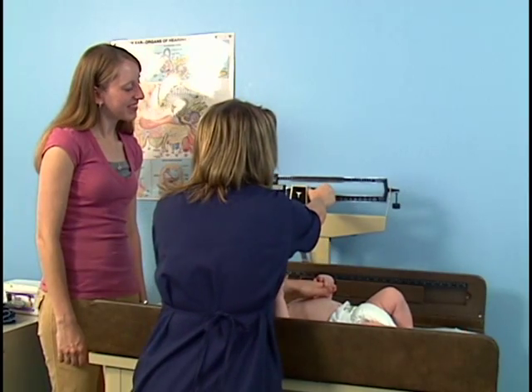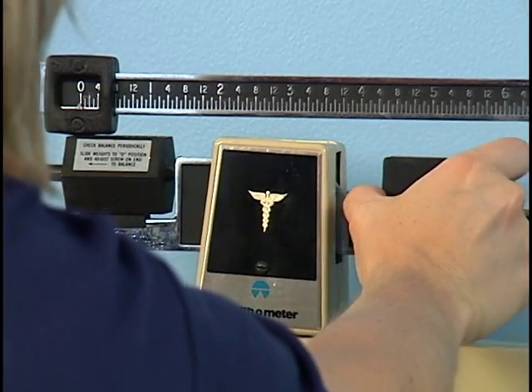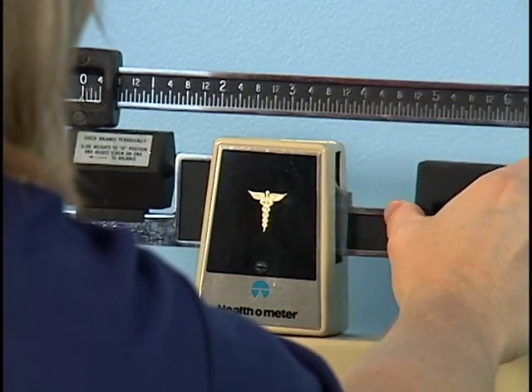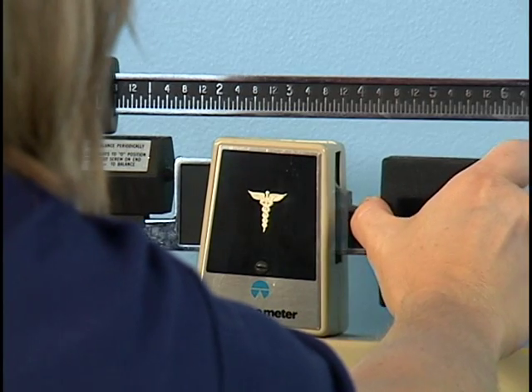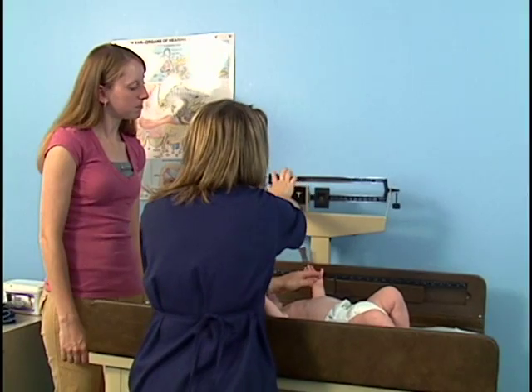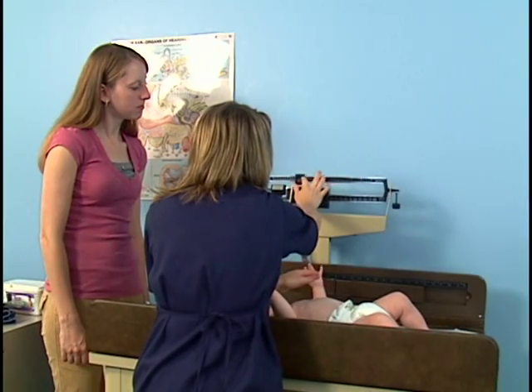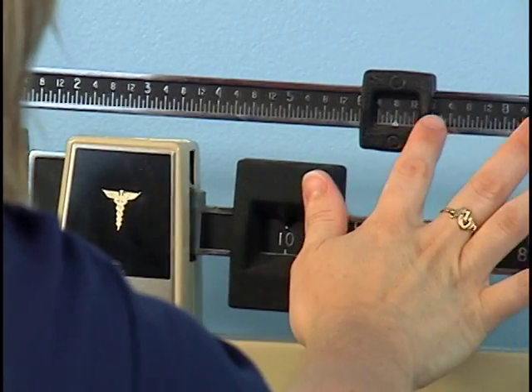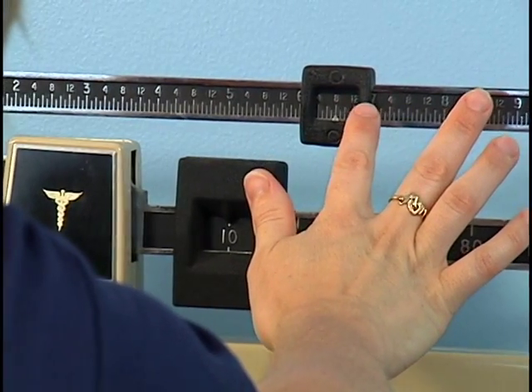Balance the scale by moving the lower weight to the notched groove that does not cause the indicator point to drop to the bottom. Make sure that the lower weight is seated firmly in its groove to ensure an accurate reading. Next, slowly slide the upper weight along its calibration bar by tapping it gently until the indicator point comes to a rest at the center of the balance area.